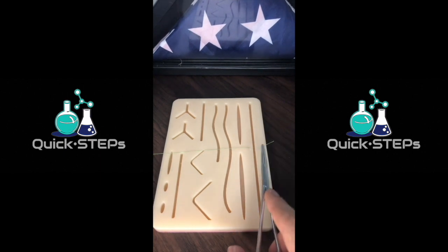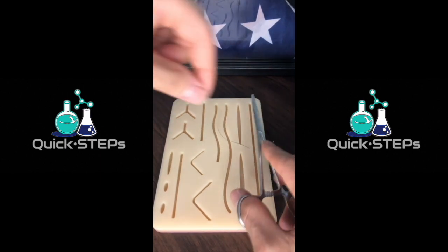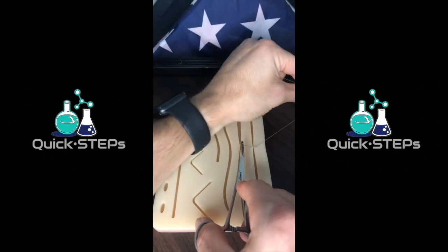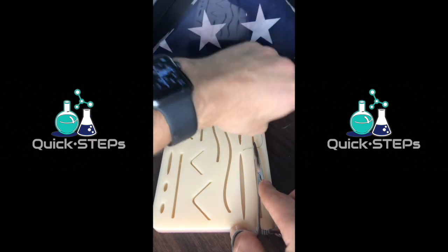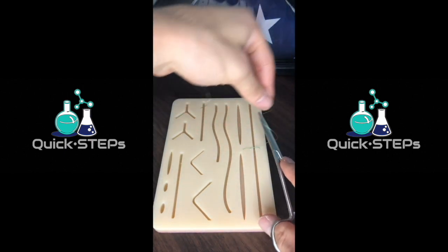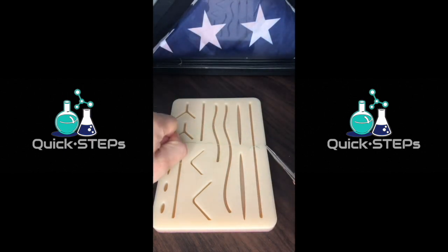We're ready for our first throw here. Tip of the needle driver right in the center, two loops around, grab the tip of the tail and pull it across. Take the long edge of the suture, just wrap it around once, pull it across.